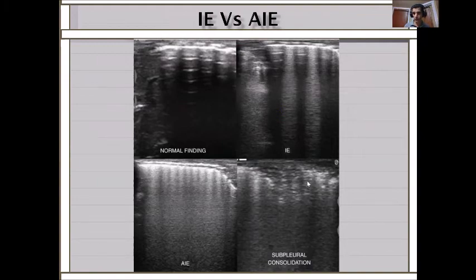There's air bronchogram. They are localized, but there is no boundary. This is consolidation. It can be collapse, it can be pneumonia. Put Doppler on it. For me, it's clearly pneumonia. I don't do that, but if you don't know, put Doppler on it. If you see increased vascularity, then this is pneumonia. If no increase, then this is collapse. If you see a boundary, it's an abscess.